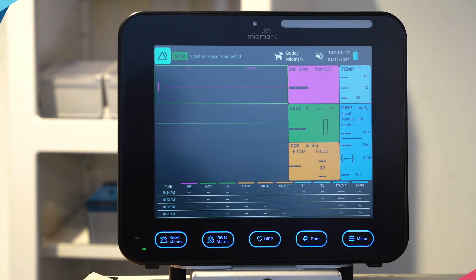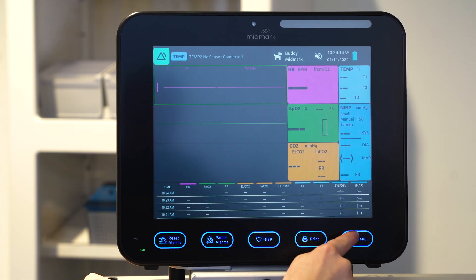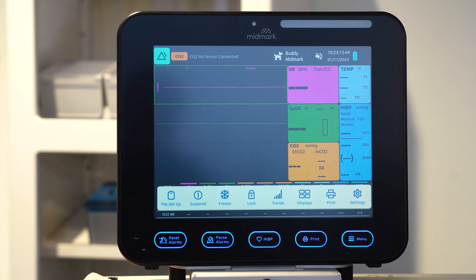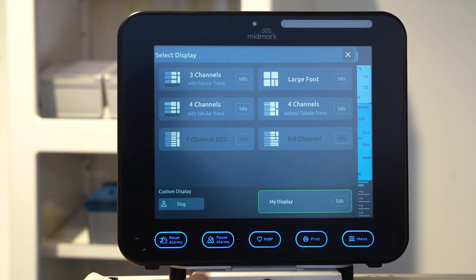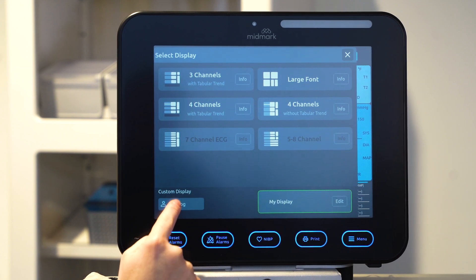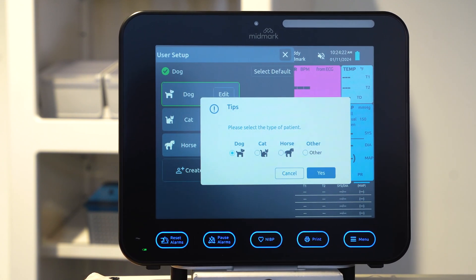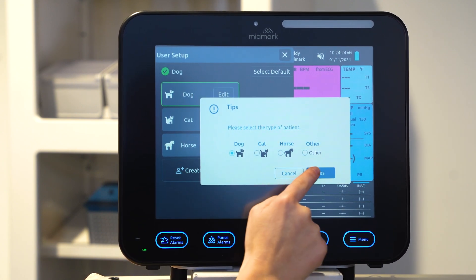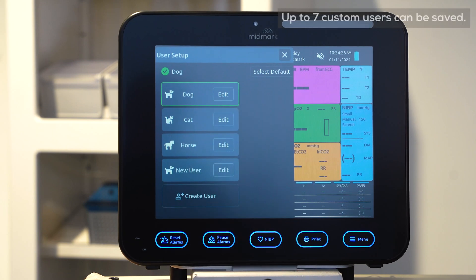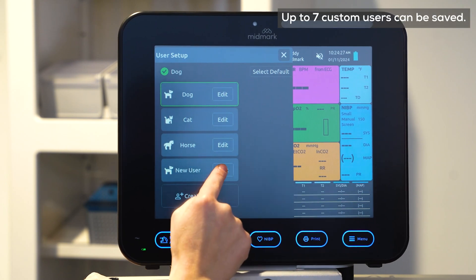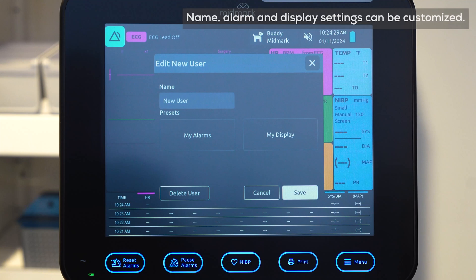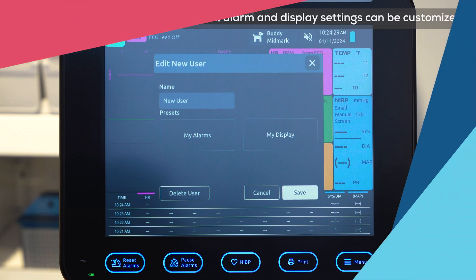To set up a custom user, select menu, then select displays, then select the user icon box. Select create user, then select patient type. A new user profile will appear. Select edit for new user, then select my alarms or my display to customize alarm or display settings.